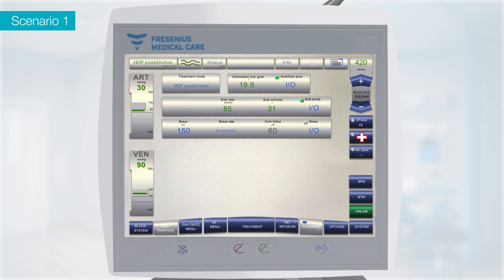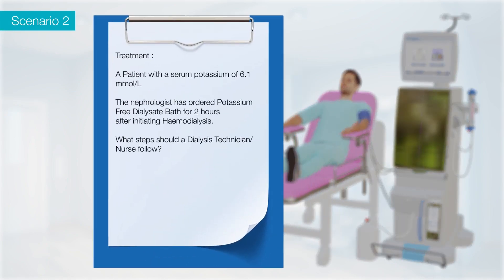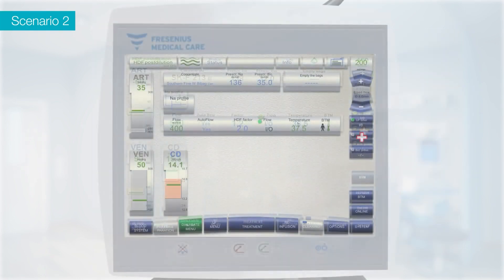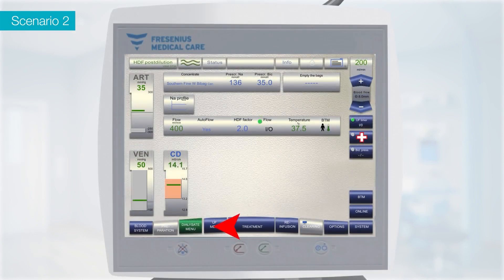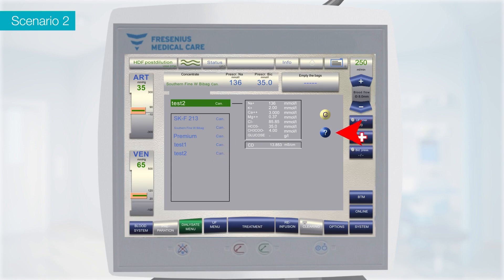If the total convective volume achieved is more than 21 to 24 litres, then this treatment can be termed as high-volume HDF. Scenario 2: A patient on chronic haemodialysis has serum potassium of 6.1 mmol/L. The nephrologist has ordered a potassium-free dialysate bath for 2 hours after initiating haemodialysis. Select the dialysate menu on the 5008S screen, click on Concentrate type, select the potassium-free (K-free) dialysate concentrate canister, and click OK to confirm.